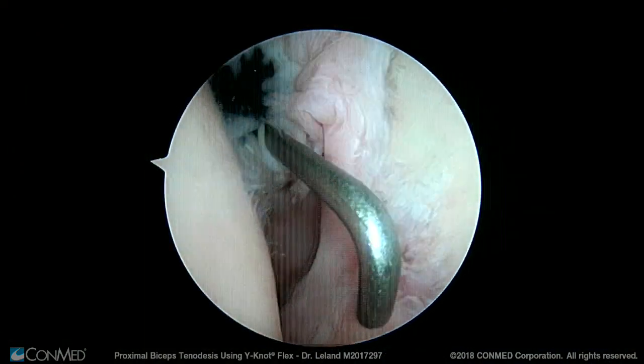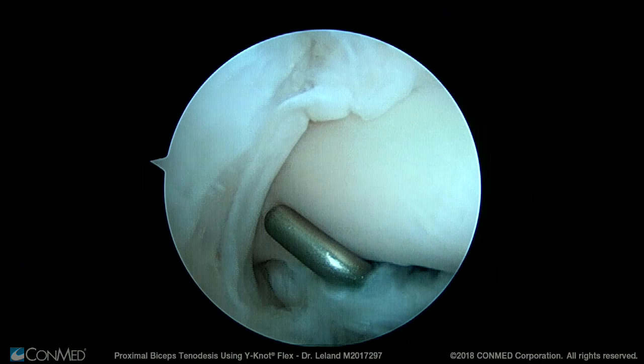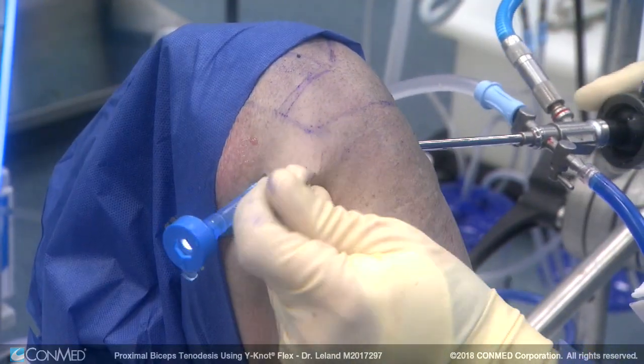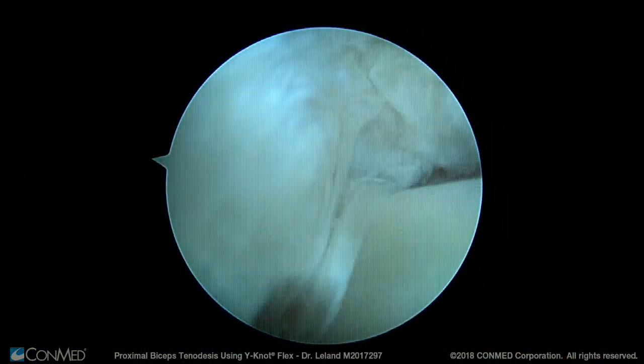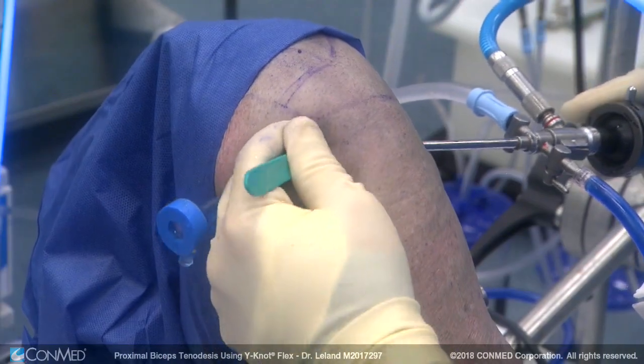Here you can see the glenoid and the humeral head of the left shoulder with the biceps tendon exiting through the biceps foramen. Once we identify the area over the biceps tendon with a spinal needle, we use an 11 blade to carefully cut the tissue overlying the biceps tendon so that we can easily identify it from the subacromial space.